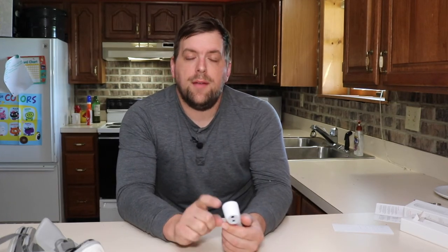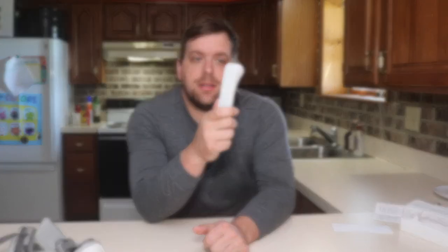It has a beautiful display. I have not figured out how to change it over to Celsius. So I was able to do some digging, and I was able to figure out how to change this over to Celsius from Fahrenheit.